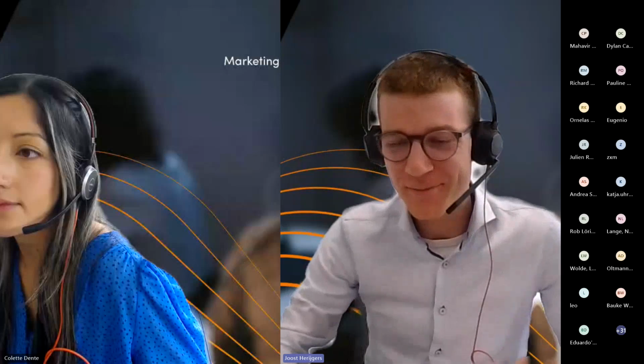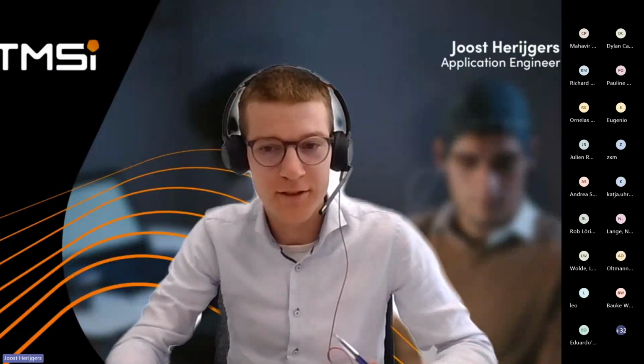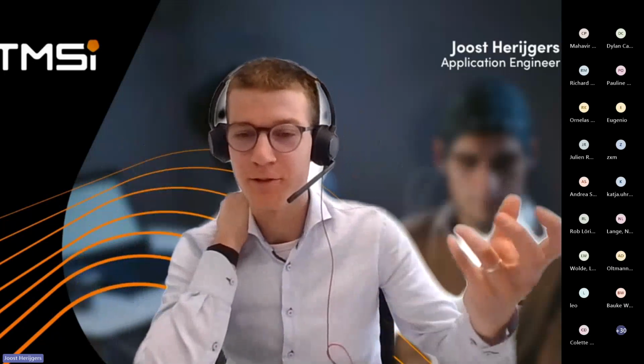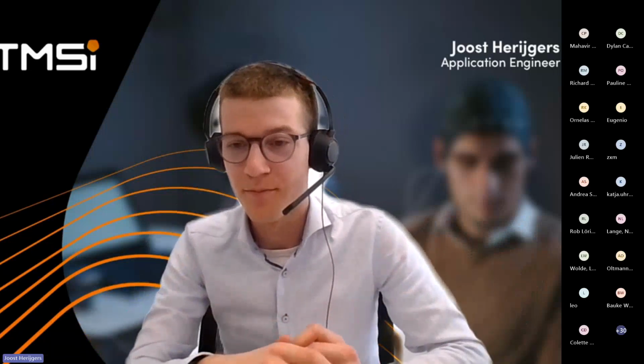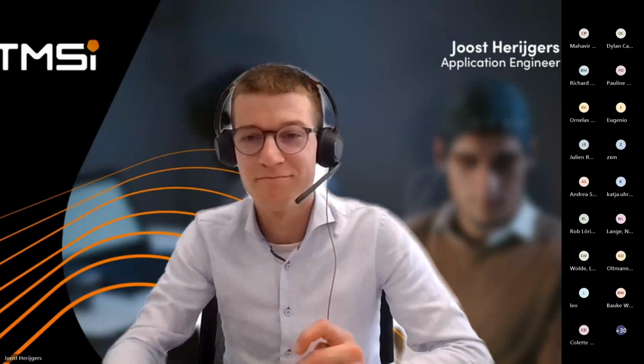Yes, this is indeed possible because in the screen that I showed at the start of the video, we configured which muscles to record from. And actually there's two fields there in which you can fill out which muscle you're recording from. And if you would use two 32 channel grids, you can then use two muscles and track them simultaneously.